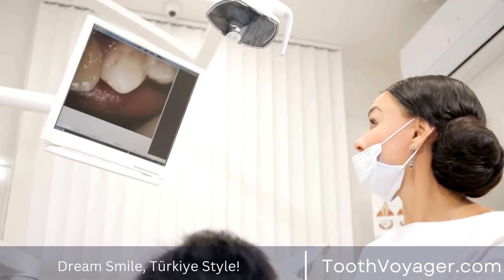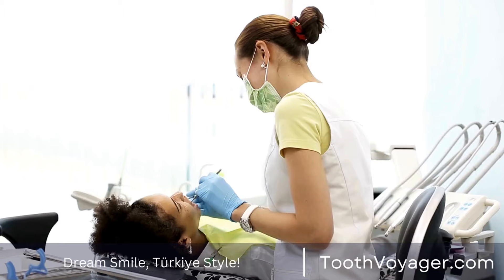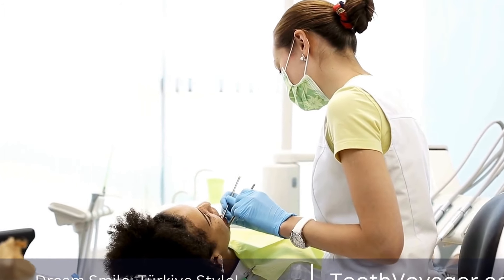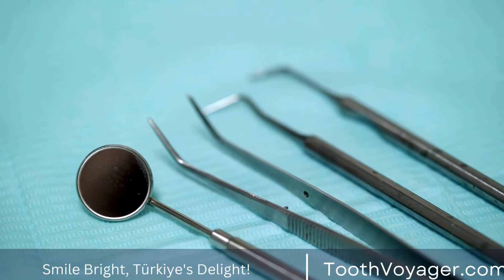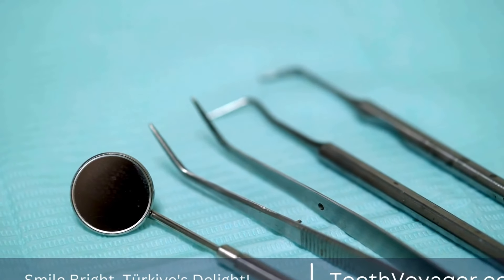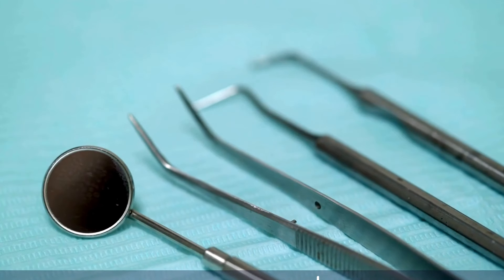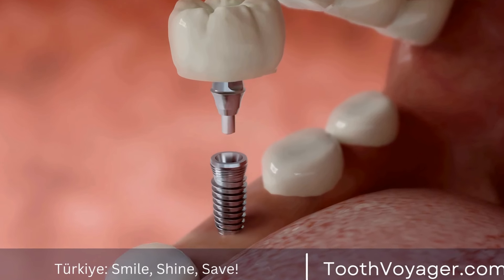Step 4: Cleaning and Shaping the Root Canals. After the pulp is removed, the dentist uses specific instruments to cleanse and shape the canals. The procedure involves the removal of affected tissue, bacteria, and other debris from the canals in order to ensure that the infection has been completely removed. The canals are then shaped in preparation for filling.